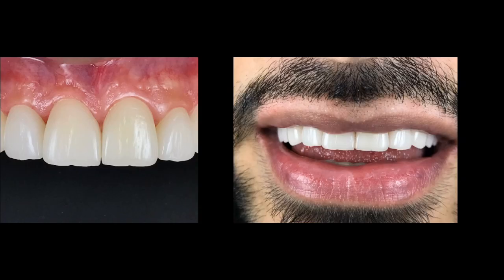We can see the integrity of the ceramic in the soft tissue after 1 week, and we can evaluate here the shade, the shape, the small details, and the relation between the teeth with the lips and the full smile, and how we reduced the black triangle on the buccal corridor.